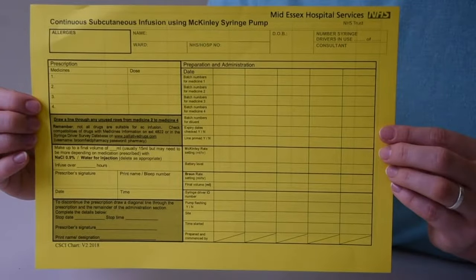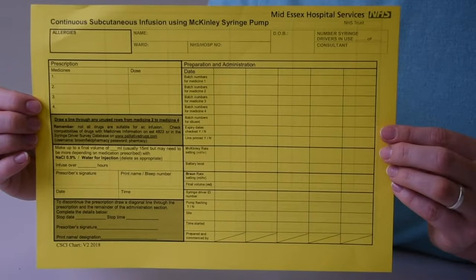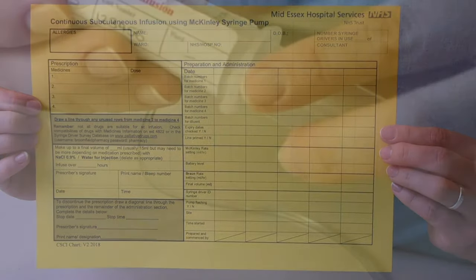Prescription. Please ensure that the patient has been correctly prescribed a CSCI on one of these yellow forms. Ensure that all appropriate fields have been completed.